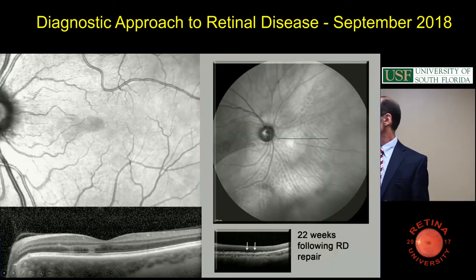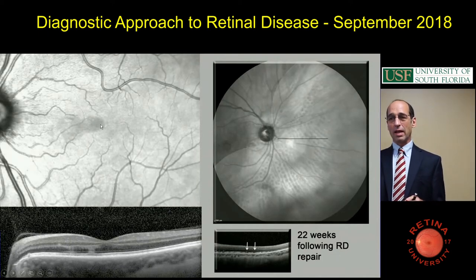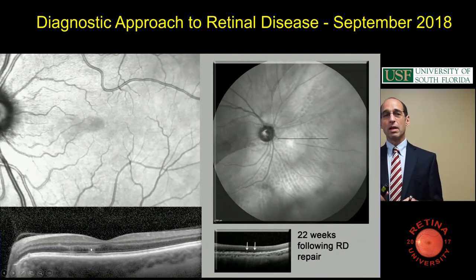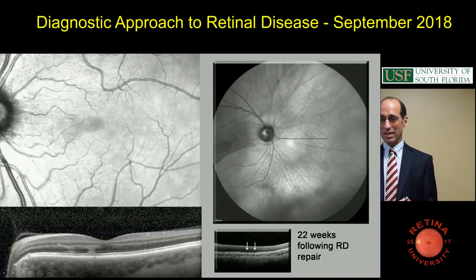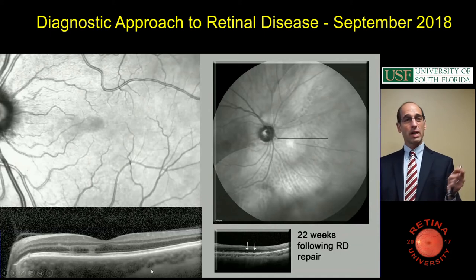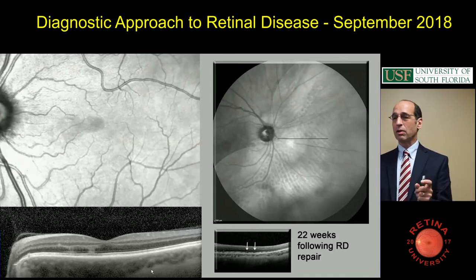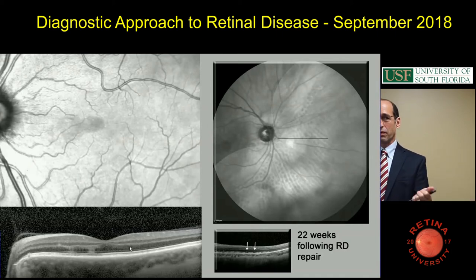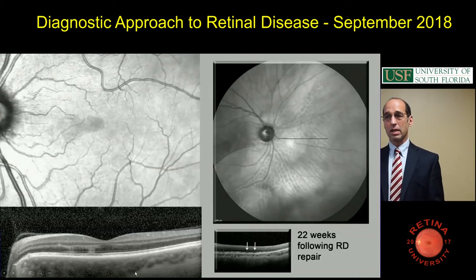And then the image on your left is acute macular neuroretinopathy, and you can see that dark spot on the infrared. I was just talking to a retina specialist pretty late, two nights ago, he called me, about a friend of his who had a paracentral scotoma and said all he saw was something on the infrared. And for acute macular neuroretinopathy, that's all you'll see. The autofluorescence is normal, FA is normal, ICG is normal, but the infrared's not. So it's a nice test for this.